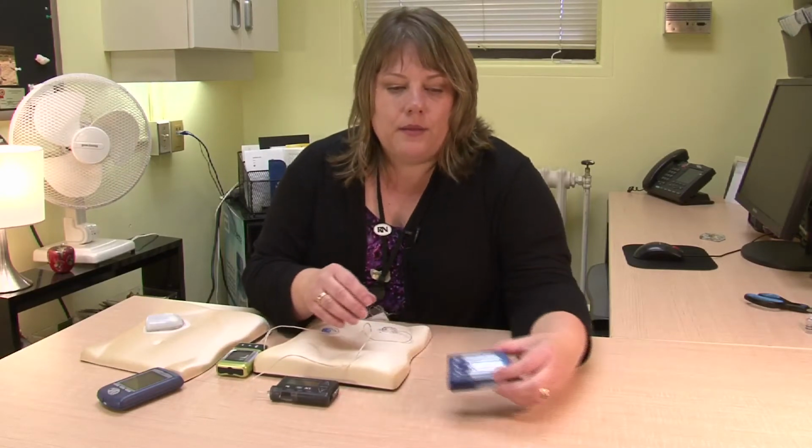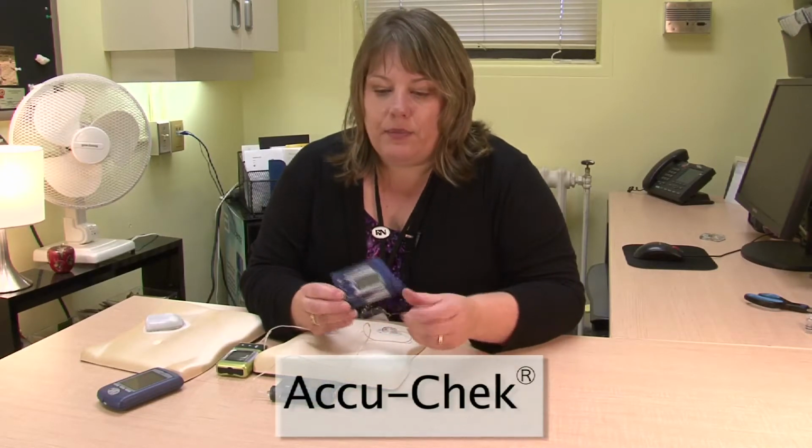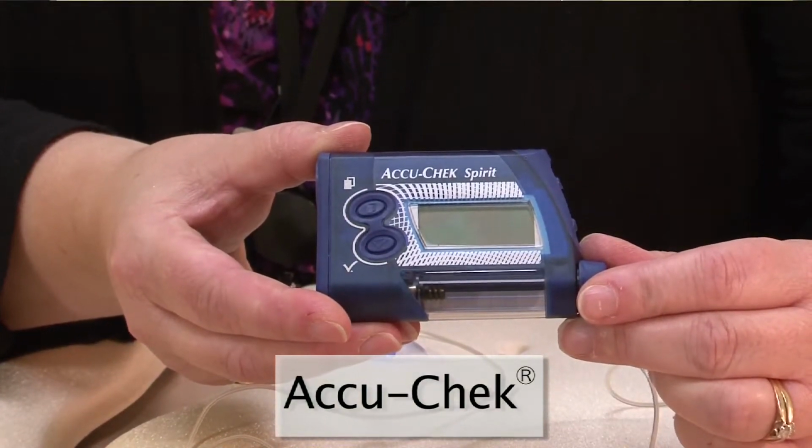Fourth pump, this one, the Accu-Chek Spirit. This pump would be the exact same thing, would have a tubing, be attached to the body, and you would wear all of the pumps really in any of the same places, and it would work the same.